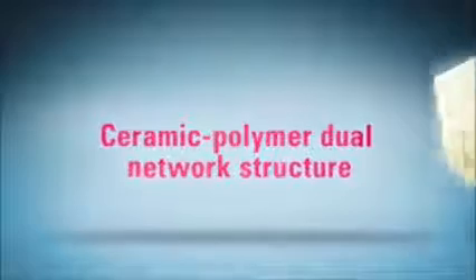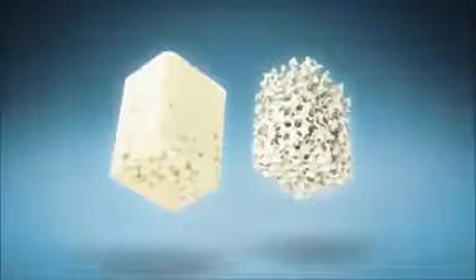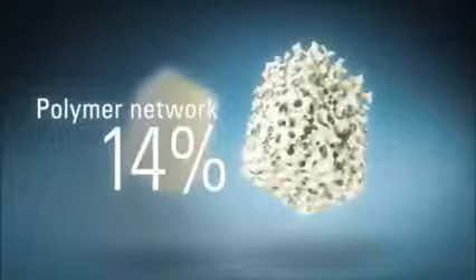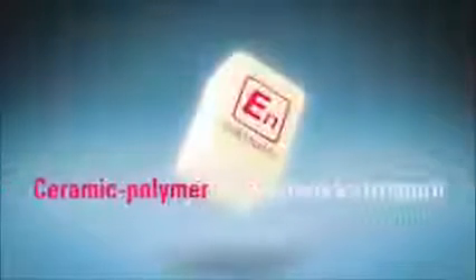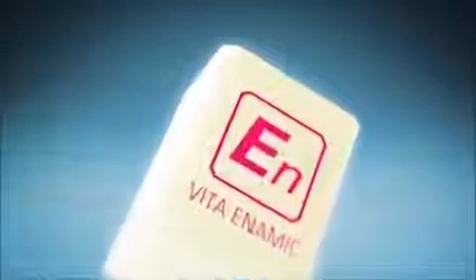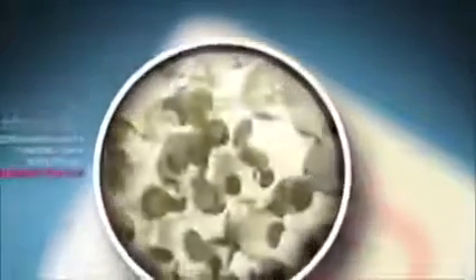Vita Enamec combines the best of both worlds. The ceramic network brings high flexural strength, while the polymer network contributes elasticity, creating a unique ceramic-polymer dual network structure. This ingenious combination of ceramic and polymer necessitates a new definition of load capacity.